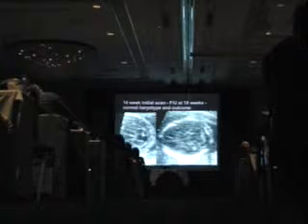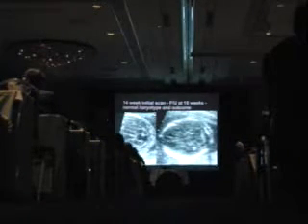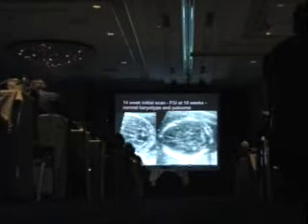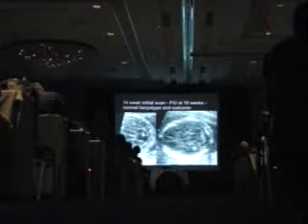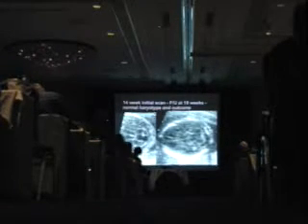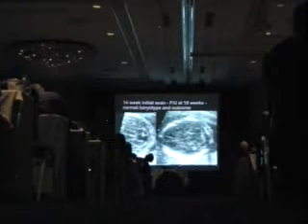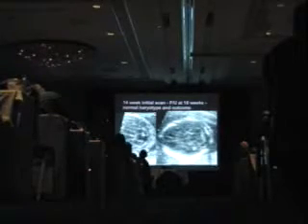We were starting with a new machine here, and we were seeing things extra well and scanning transvaginally. We had 3 of these in one day. So I figured, well, something's going on. I went back to the embryology books, Moore's embryology, and it says there that the vermis doesn't finish forming until 16 to 17 weeks. So do not look for items that have not formed, because they won't be there.